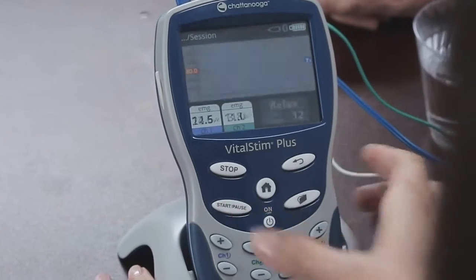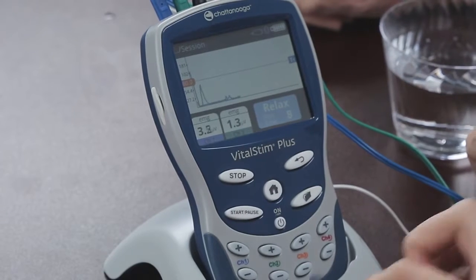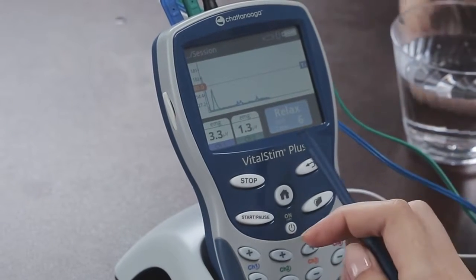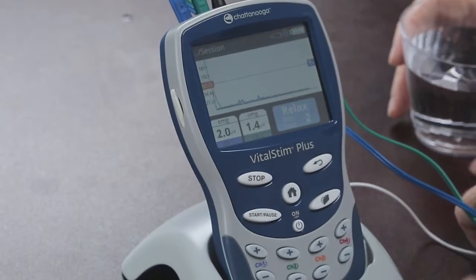And once we are at the right level, press Start, Pause, and the machine will start in relax mode. In relax mode, the instructions will be provided to the patient to say, okay, get ready. You're going to be asked to swallow.